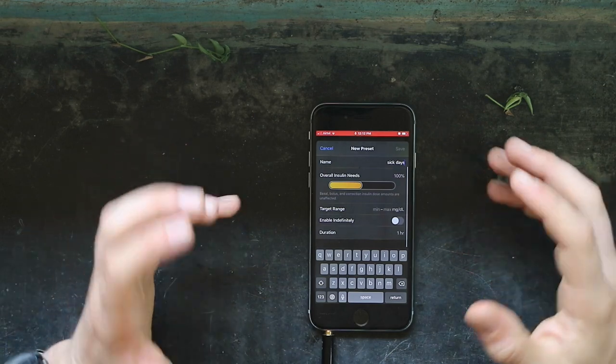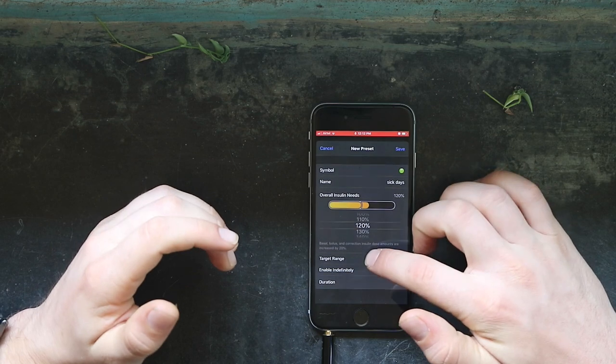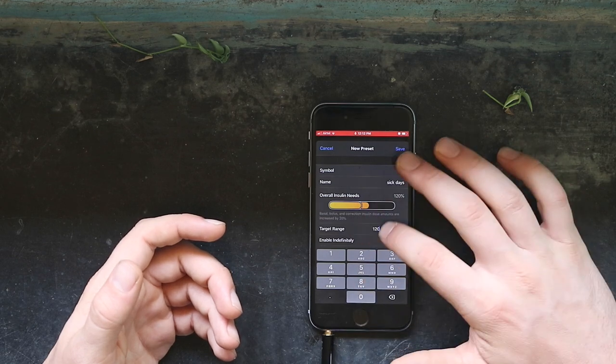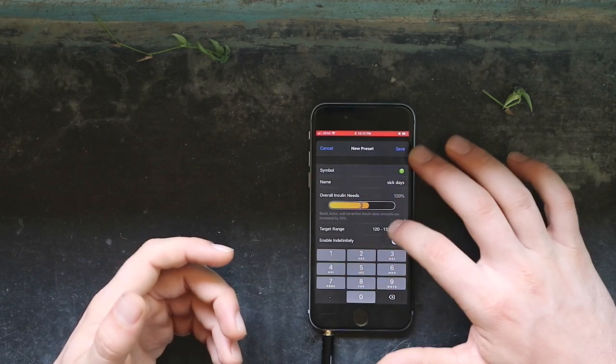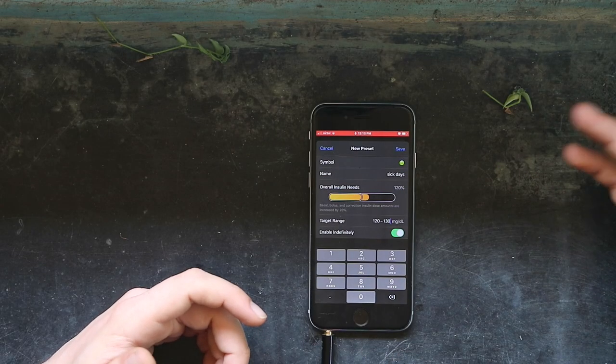From here you will change your overall insulin needs. This isn't just a reduction in basal rate like with the Medtronic 670G — this reduces your carb ratios, your sensitivity ratios, everything, which is really important for diabetes management. On a sick day you might need an increase of say 20%, and you might want to bump up your target range so you aren't dropping low from the extra insulin — maybe from 100 up to 120, with the upper high at 130. If you're not sure how long it will last, you can enable it indefinitely or set a duration, like 12 hours if you know you'll be in bed all day, and then turn it off when you're feeling better.